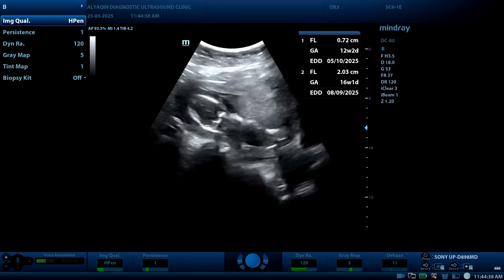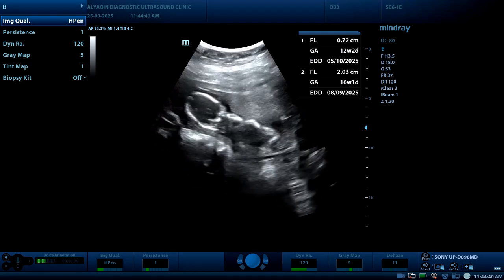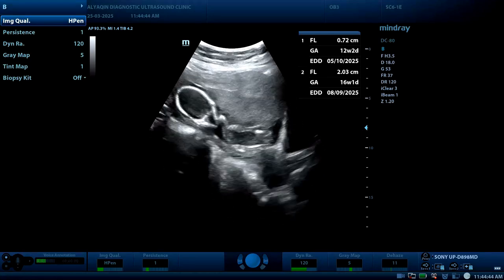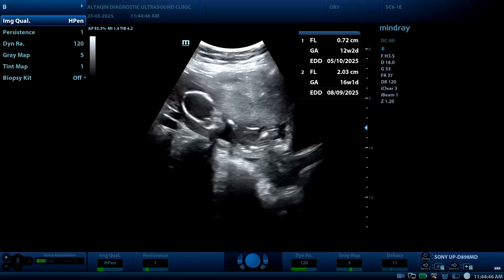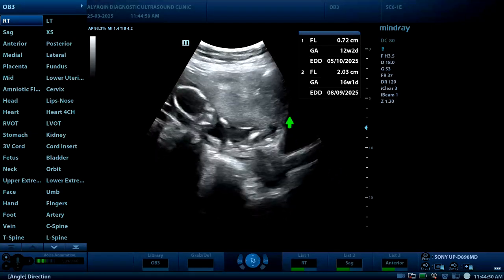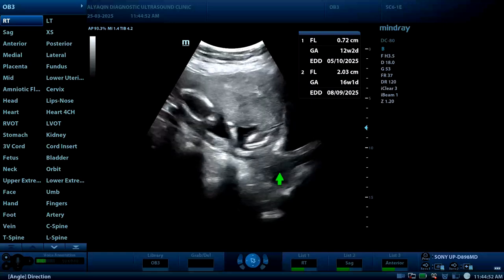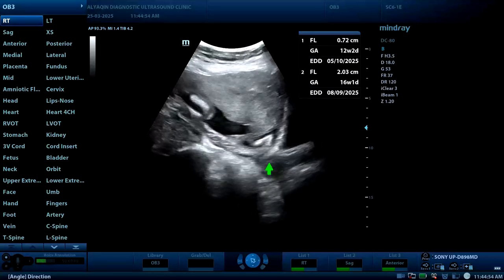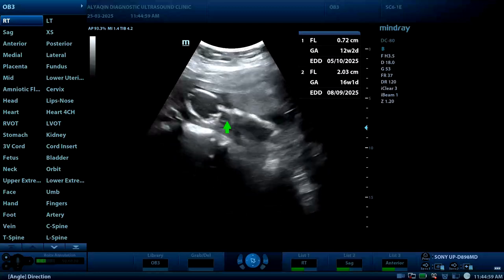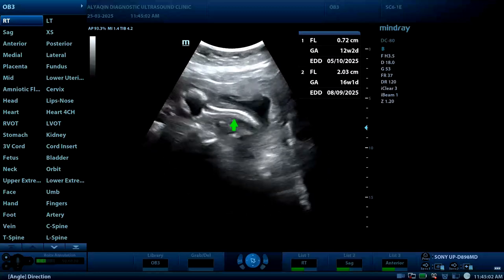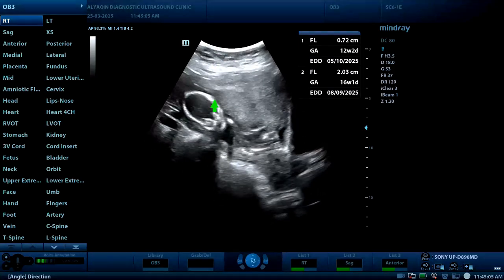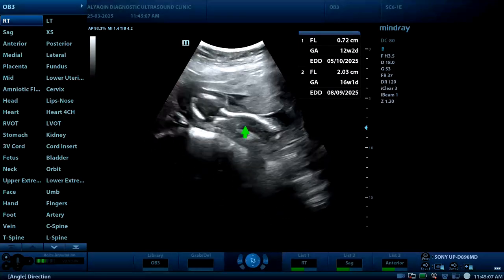Here is an obstetric routine exam. The probe is at the suprapubic region. In this view, we can identify the bladder, cervical canal, and uterus, and this is the fetal body. The patient is obese, so the resolution is not perfect.